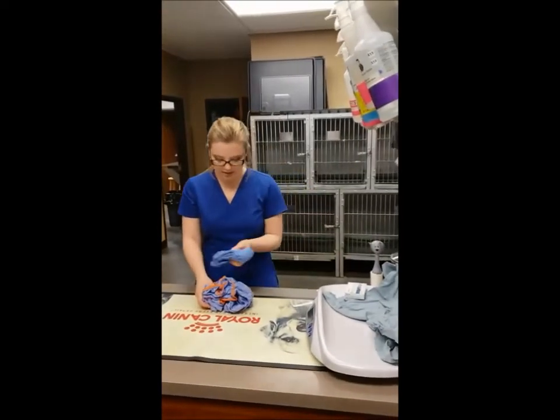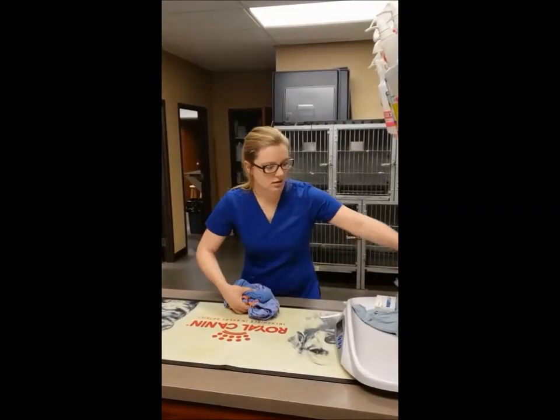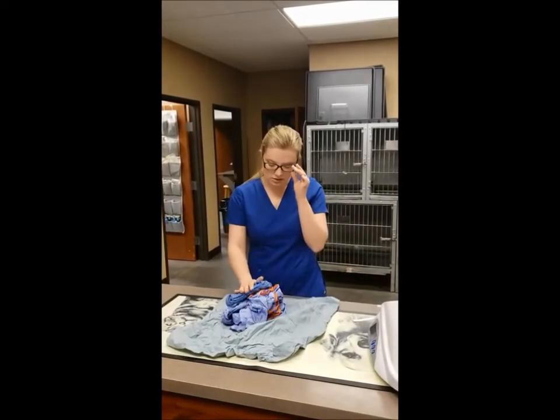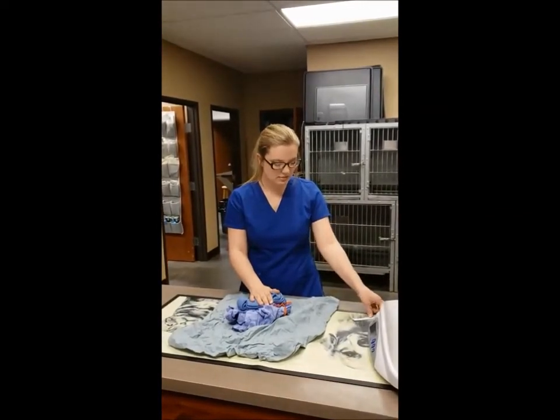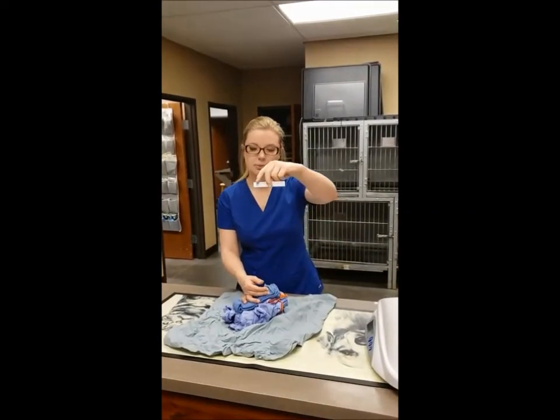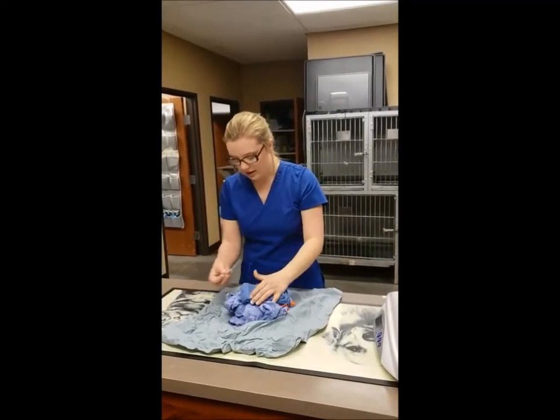And then you want to put this on top because this is what they're going to dry their hands off with. And so here's my towel. I'm going to put this on here. To ensure that this is sterile, you're going to put a steam indicator strip here. And so once this is autoclaved, this blue box is going to turn black. And that's how you're going to know that this is sterile. So I'll go ahead and put this in here.